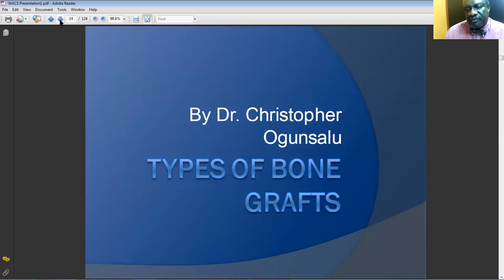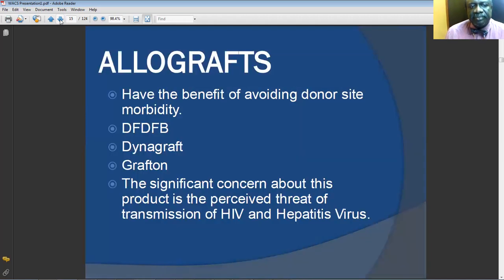The foundation for placement of implant, I have shown you a situation where there is bone, and you can sink the implant into this lovely bone without any sort of bone grafting. But there are situations where you will have to prepare the alveolar bone to receive implant. So you need to understand the type of bone graft that will be needed.